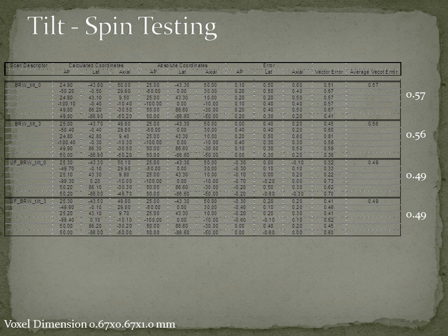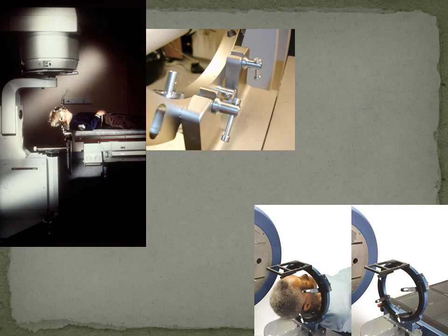And so we constantly are testing this with all of those errors I talked about to make sure that things are aligned. We then take that system and bring it to our delivery system and lock it in, and we then actually treat that target and make sure that from the imaging all the way through we've checked the system from one end to the other.